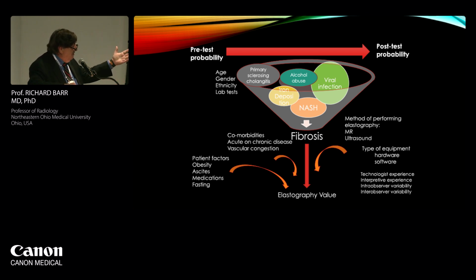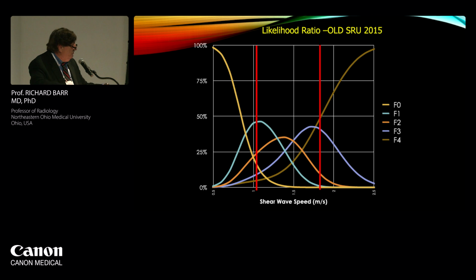Also, we have MR and we have ultrasound, and within ultrasound, we have a couple different types of ultrasound. So all these things affect, and this is a very, very difficult exam, and I don't have time to go over everything, but I do recommend if you're doing this, you read the guidelines. You need to do all those pieces that we talk about to get a good value.